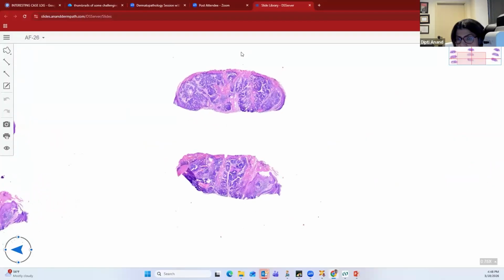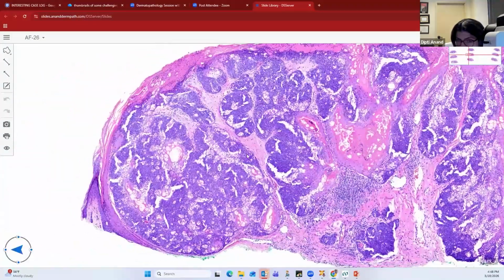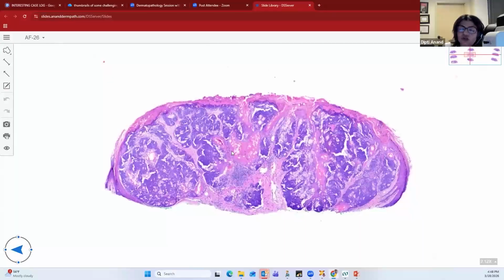Here you will get the proliferation of the sebocytes and the basaloid cells, but the basaloid cells are forming more than 40%, 50% of the lesion. So you mostly see the blue areas. Sebaceomas or sebaceous epitheliomas will be your closest mimicker of a sebaceous carcinoma.